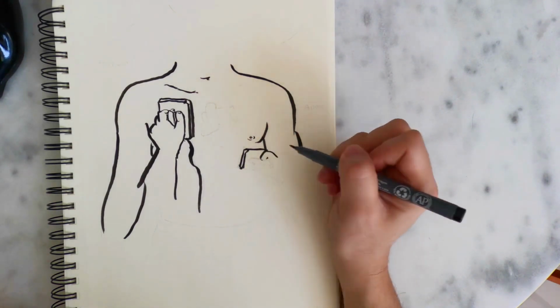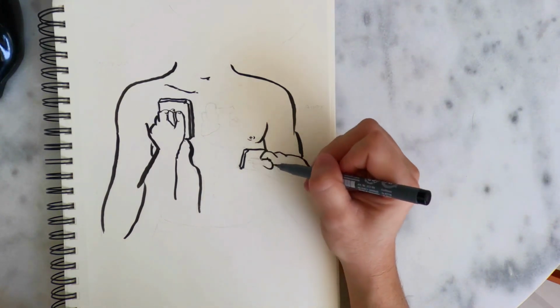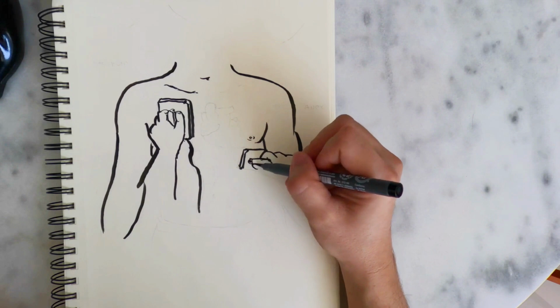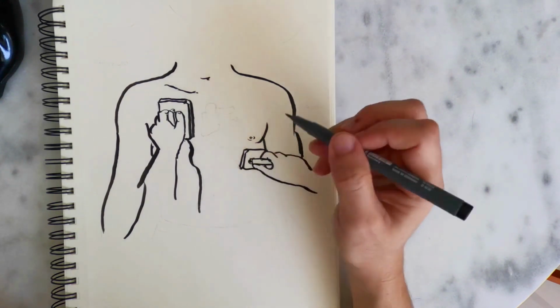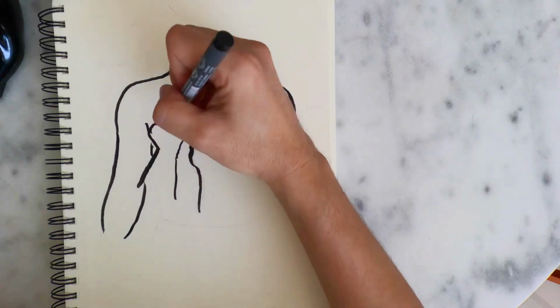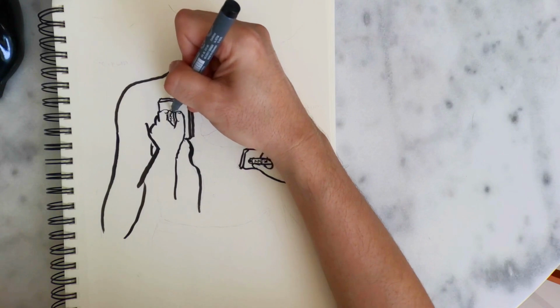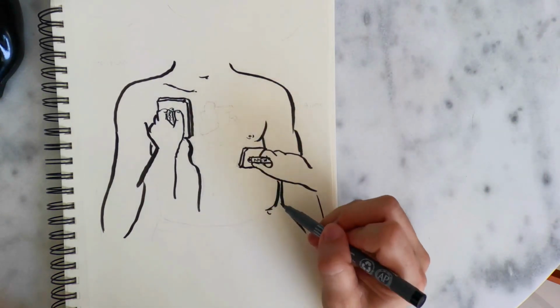There is a question that I often get. Some patients may have a pacemaker implanted in their chest. Some patients are older and their hearts are a bit challenging, but the doctor will have a device to implant under the skin to make the heart beat faster and return to a normal rhythm, which is called a pacemaker. Generally, pacemakers are not placed on the right side. They are mostly implanted on the left side.